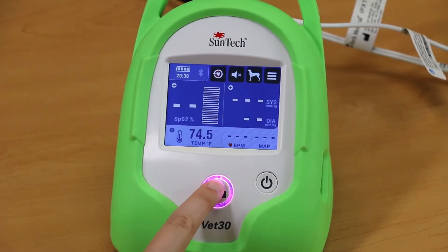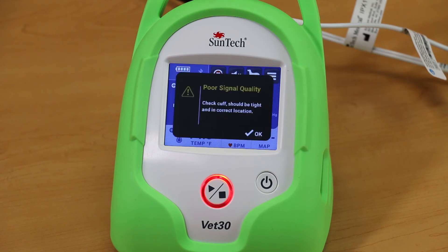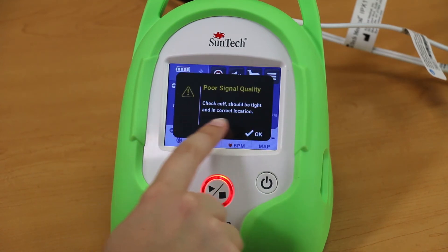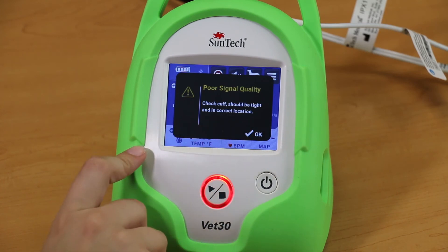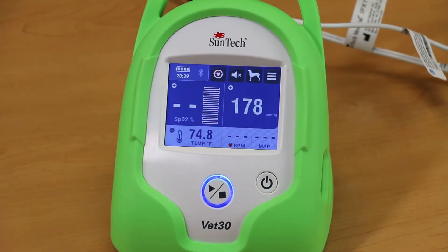If you see a status message during a reading, follow the instructions located on the screen. These messages provide information on what went wrong and also have suggestions to fix the problem. There is no need to look up an error code in the manual. If you need to stop a BP measurement at any time, simply press the Start-Stop button.